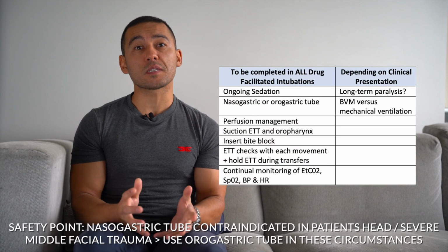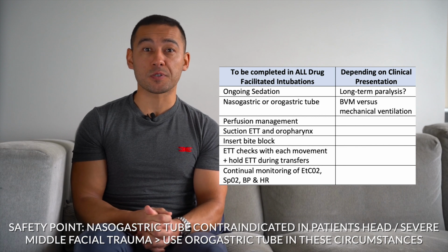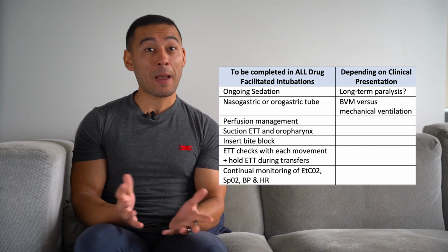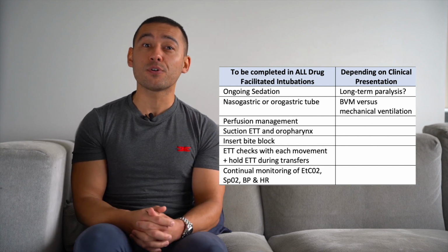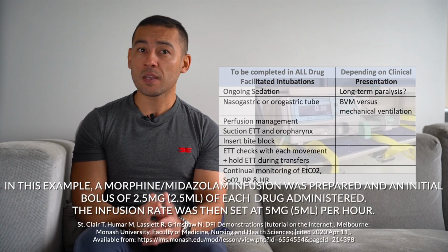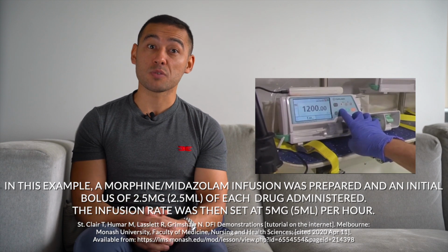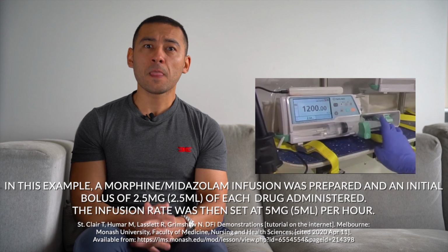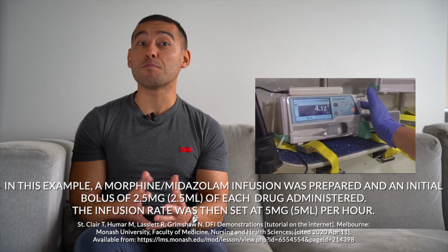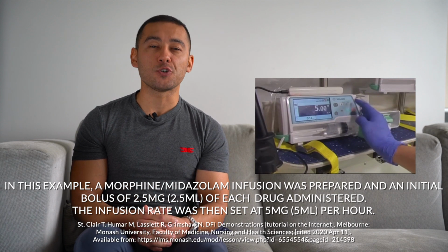In the first instance, a naso or orogastric tube should be inserted to aspirate gastric contents and decompress the stomach. At around the same time, post-intubation sedation should be provided. For the patient, having a piece of plastic rammed down their throat to deliver an unnatural form of ventilation is both physically and psychologically uncomfortable. Therefore, a combination of a sedative, such as midazolam, and an analgesic, such as morphine or fentanyl, should be administered. Depending on the post-intubation blood pressure, it may be appropriate to provide an initial bolus of medications to ensure good therapeutic levels of sedation before setting an infusion rate.